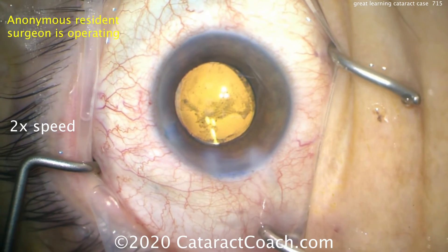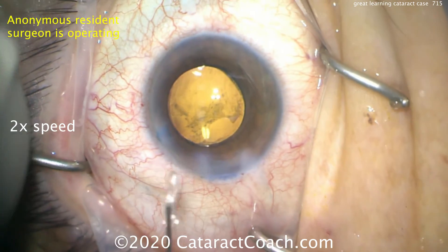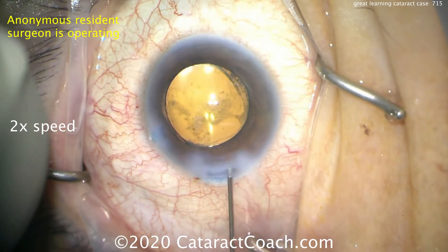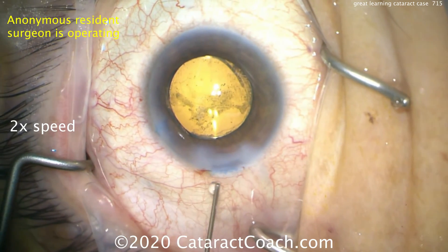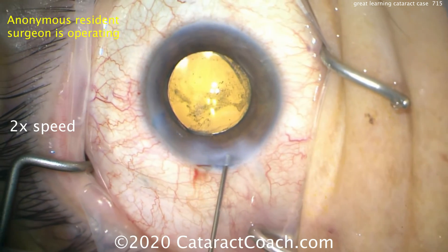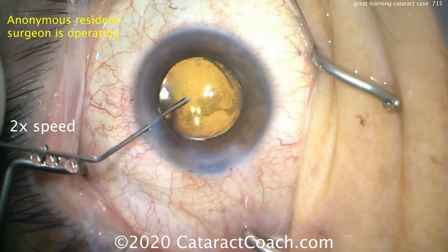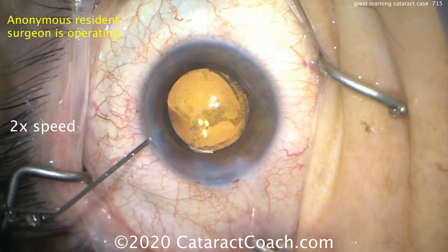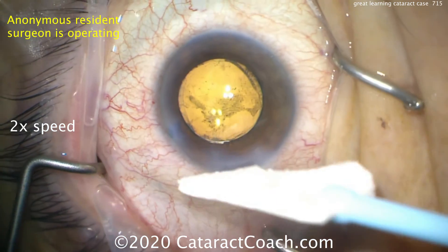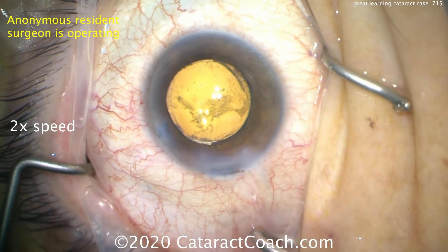Centering up the lens, and now it's time to seal up the incisions. Watch carefully — here's the right way to seal up an incision. A little bit of hydration back and forth, mid-stroma, not near the Descemet's attachment. You don't need a huge amount. If you're doing very large white boluses on either side of the incision, that's really not nearly as effective as what I'm showing you. Great case — I hope you learned a lot. Beautiful case for a resident. Keep up the good work, and I hope to see you progress even more.